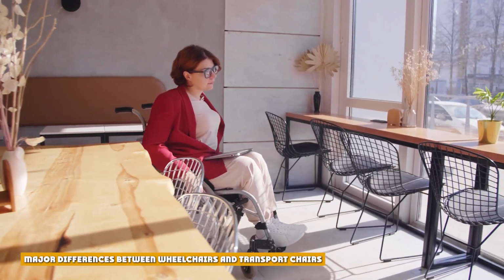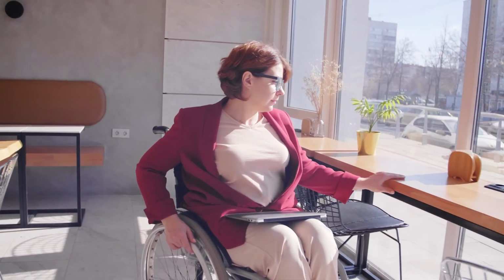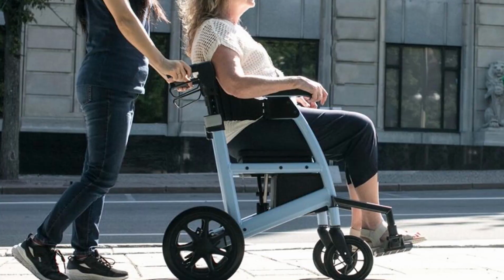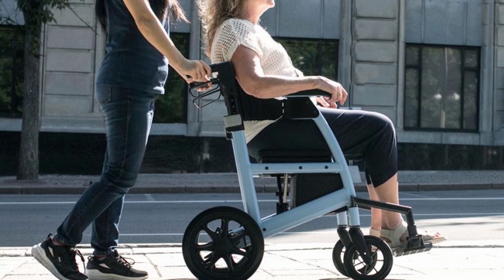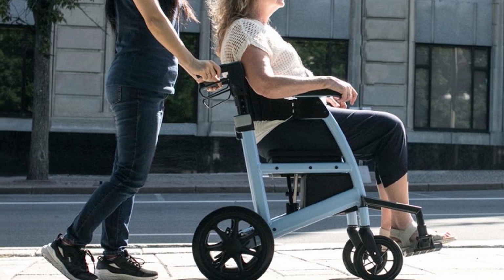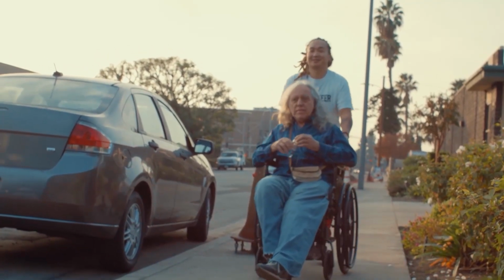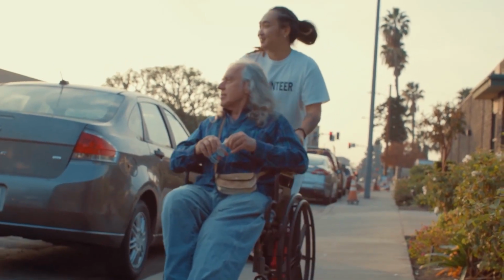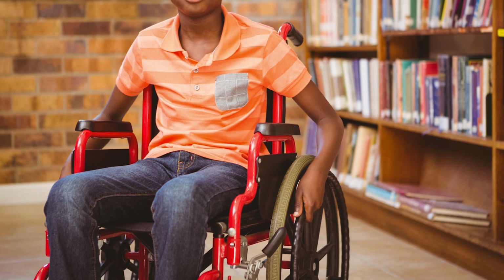Major differences between wheelchairs and transport chairs. The key distinction is in how each of these chairs is propelled forward. As previously mentioned, lightweight transport chairs are not designed for independent use. They can only be operated if a second, able-bodied person pushes the chair forwards. That said, in some circumstances, a transport chair can be used as a makeshift walker if the primary user is able-bodied enough to stand behind and push the chair forward.